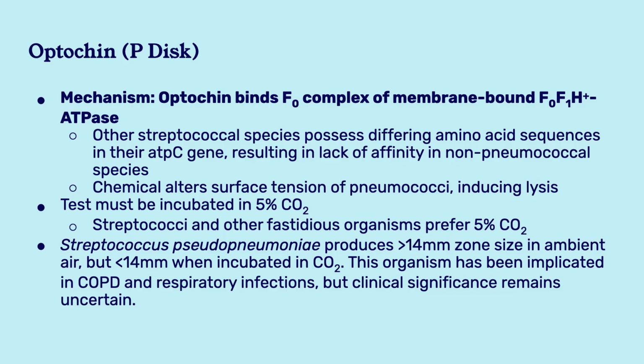Streptococcus pseudopneumoniae produces a zone size greater than 14 millimeters in ambient air, but less than 14 millimeters when incubated in CO2. This organism has been implicated in COPD and respiratory infections, but its clinical significance remains uncertain.